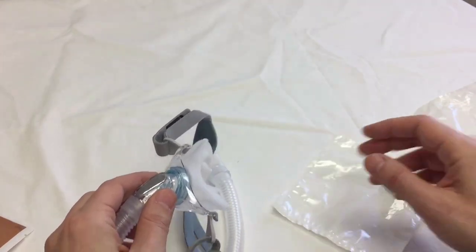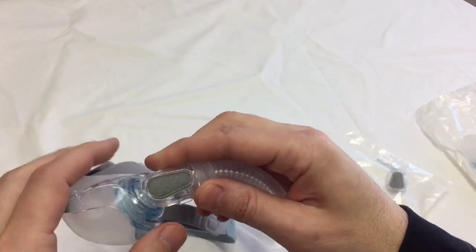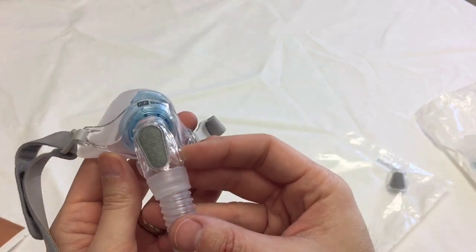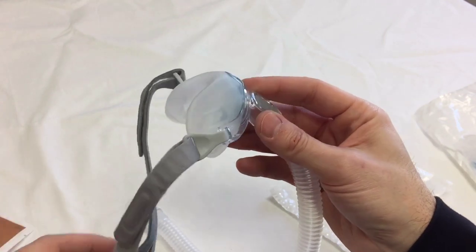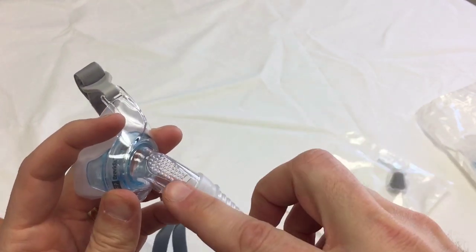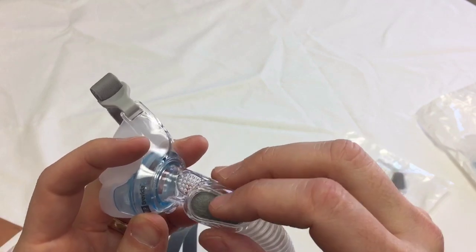That's the washable diffuser filter, and we'll get a better close-up look at that. So this piece right here is the diffuser filter. Right there, it snaps on and off, and there's the exhalation ports behind it. You can use the mask without it.